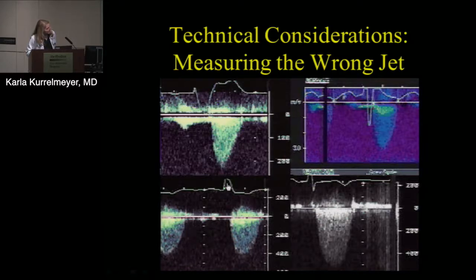This one is actually tricuspid regurgitation, believe it or not. So if you've got wide open tricuspid regurgitation, you can see that there's something here in the inflow, probably not AI. This one, I think, is just regular tricuspid regurgitation, and this, of course, is mitral regurgitation. And you can see that there's things there. You can't really tell it very well. So it would be very important in some of these to go back and measure that ejection time.